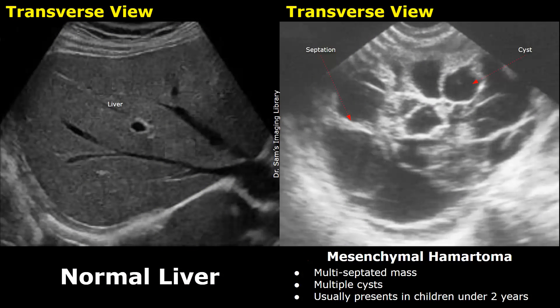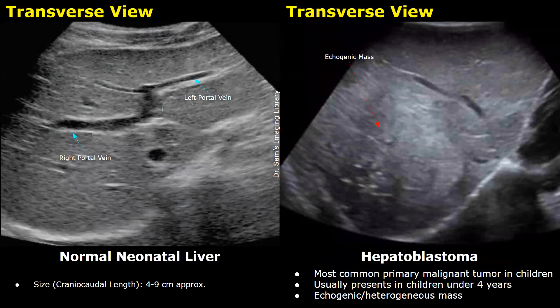A mesenchymal hamartoma is a benign tumor which appears as a multiloculated mass with multiple cysts, usually presenting in children under two years. Although benign, there is some risk of malignancy. A hepatoblastoma is the most common primary malignant tumor in children, usually presenting under four years of age. It also appears as an echogenic heterogeneous mass, with some overlap with the appearance of a large hemangioma, making it a somewhat non-specific finding.